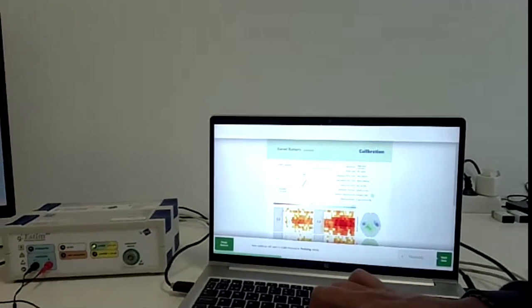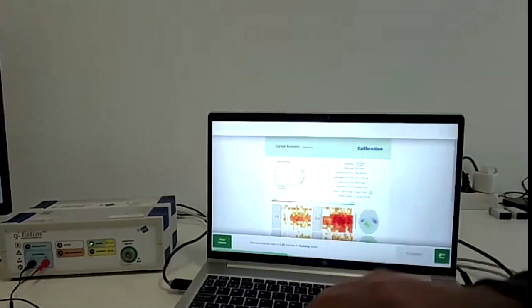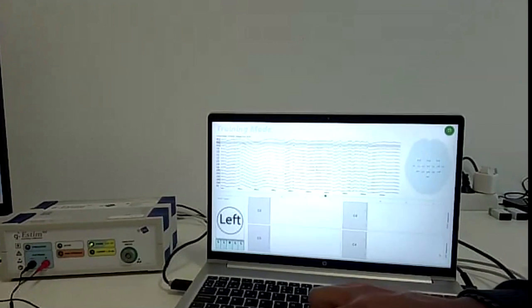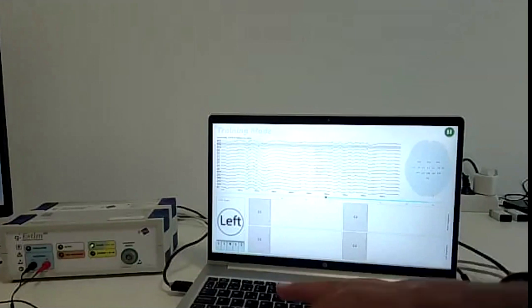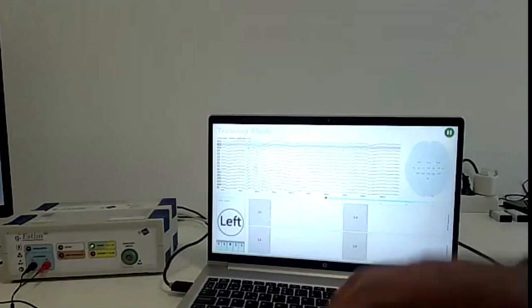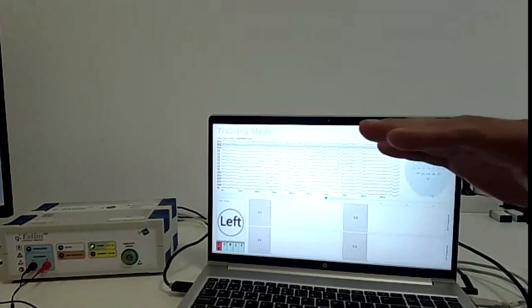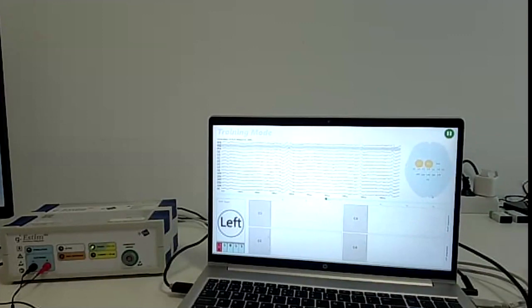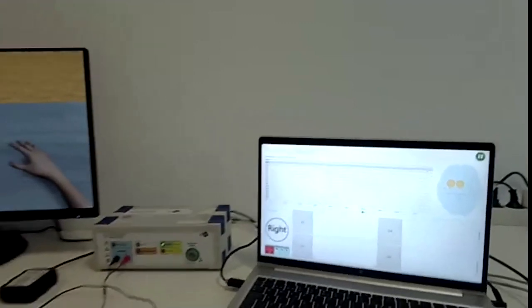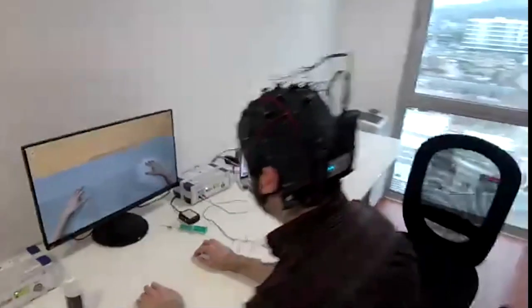So now we can go to the training. The system is already calibrated, so we can go to the training mode. In this training mode, the feedback will be only delivered if the patient is activating the movement well in his brain. So you don't move the hands, just let the stimulation activate the movement. Okay, so I will put my computer here in a general view.